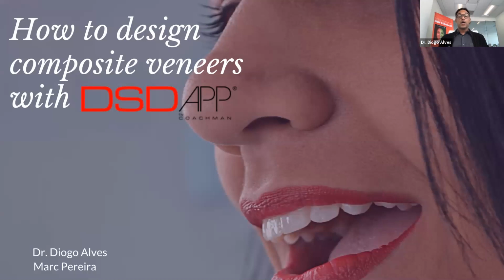Just a heads up, we are going to launch an online composite veneers course where you will learn the entire digital workflow from the beginning to the end, using the digital workflow of DSDAPP. Today, you'll be learning more on how you can use this entire workflow, and we will be showing you every single step of it.